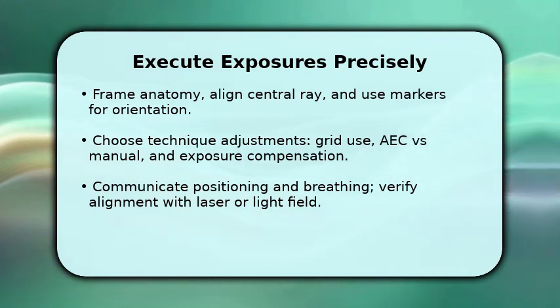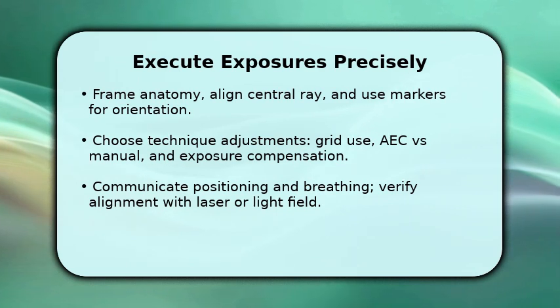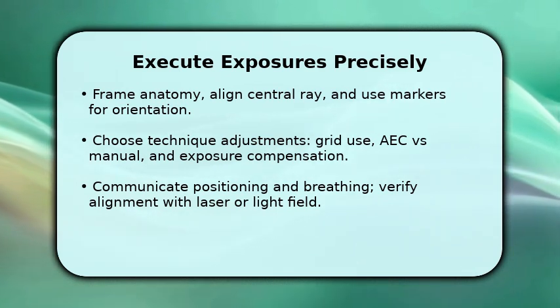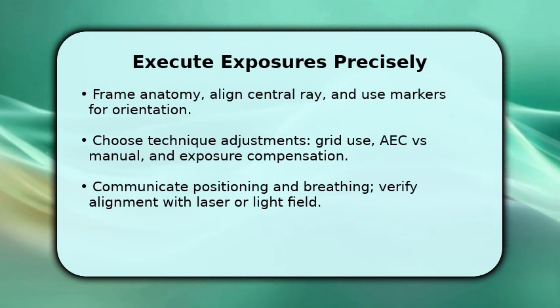Decide between AEC and manual technique. If using manual, adjust kVp and mAs as needed for tissue thickness and use a grid for thickness above about 10 cm. Check alignment with the light field or lasers and reconfirm immobilization.